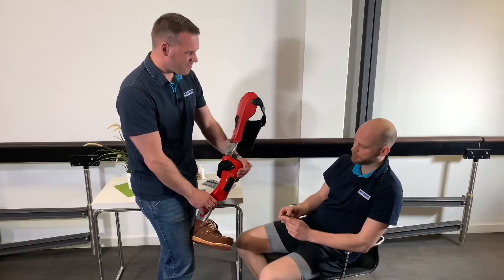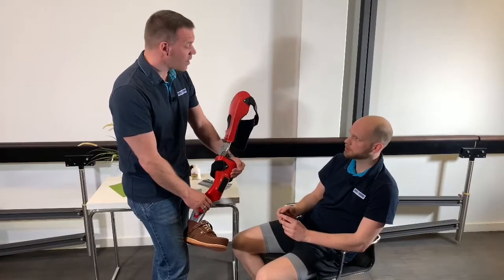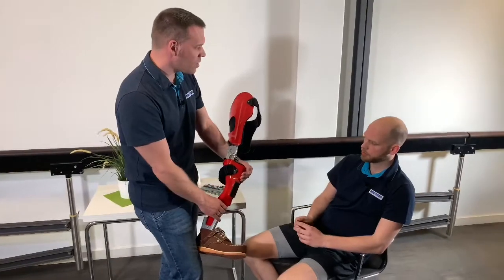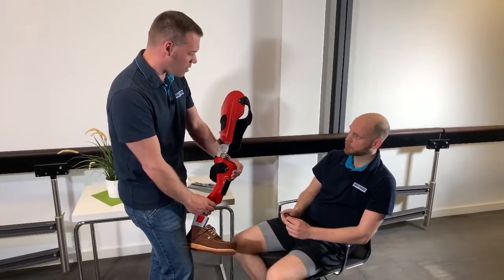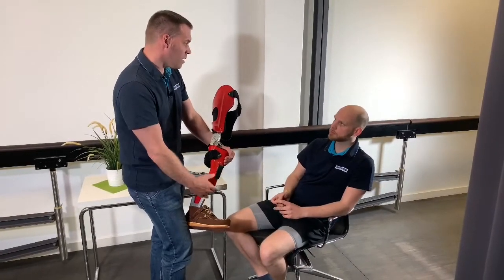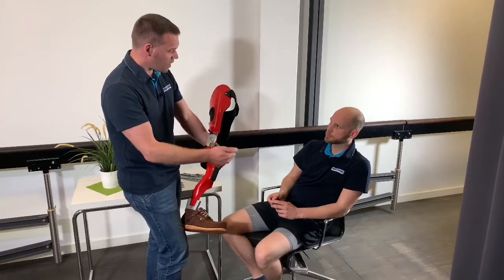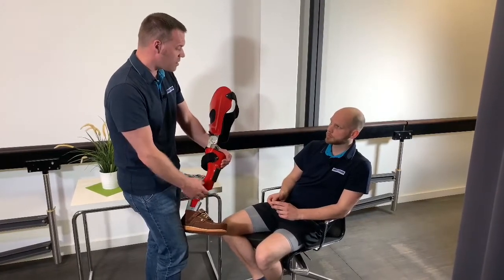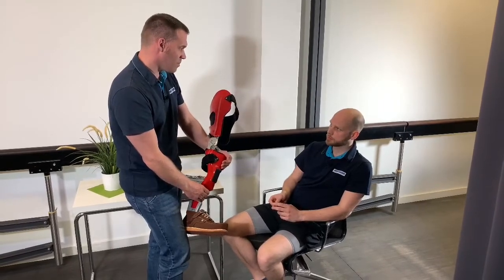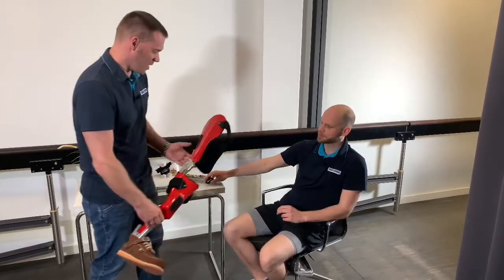Are there any other ways to check the battery status? Yes, of course. In this case, we have decided to use a Bluetooth version. This gives you the possibility to operate the system with your smartphone as well as your remote control. We can install a user app, and then you will be able to select the function mode, read the battery status, and also see how many steps you have completed with this system. So let's try the orthosis — why don't you just put it on?